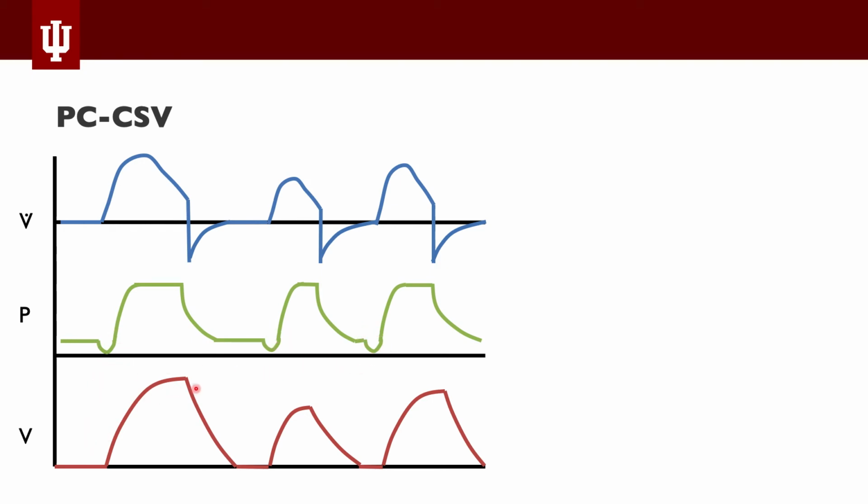The tidal volumes can change depending on how much effort the patient is making, and the flows change depending on how much effort the patient is making. As I said before, the patient controls how long the breath is. So you might have a long breath and a short breath, and essentially at some point when the flow goes down, the ventilator will sense that the patient is starting to end their breath, and they'll just stop it once they sense that the patient is kind of ending the breath.